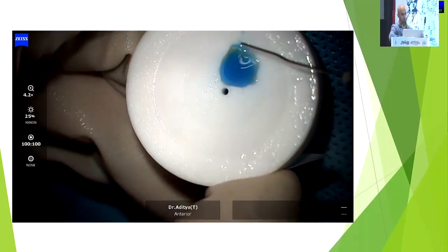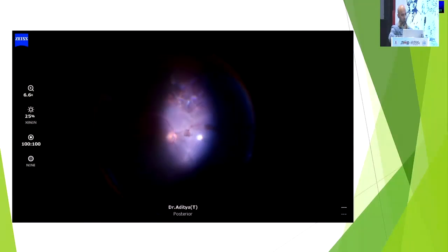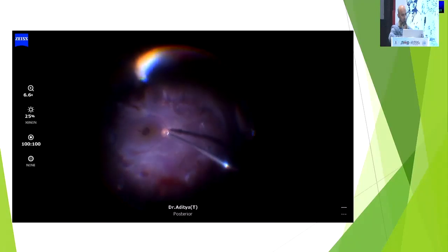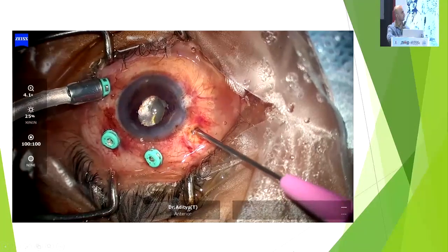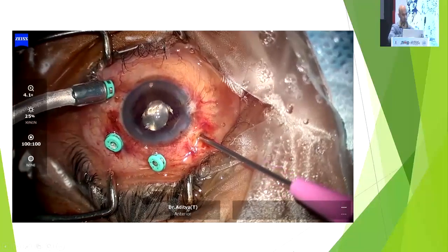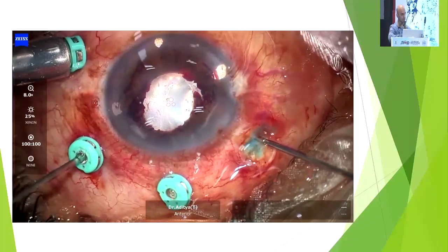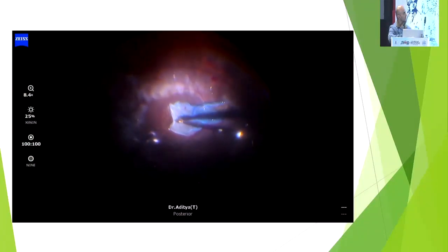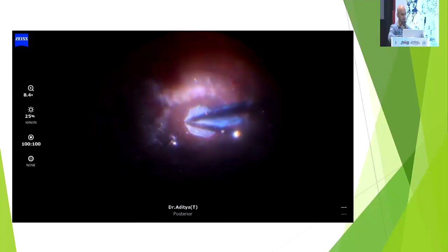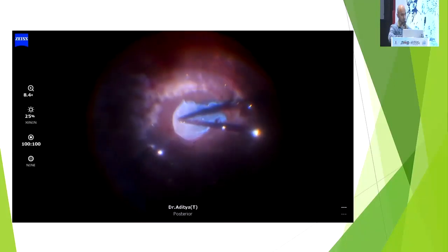I purposely used a large amniotic membrane graft, almost 4 or 5 millimeters in size, almost covering the entire posterior pole. I enlarged the sclerotomy here because putting this large sheet of amniotic membrane graft was otherwise impossible. Under PFCL, this flap was placed on the macular hole and the area surrounding it.